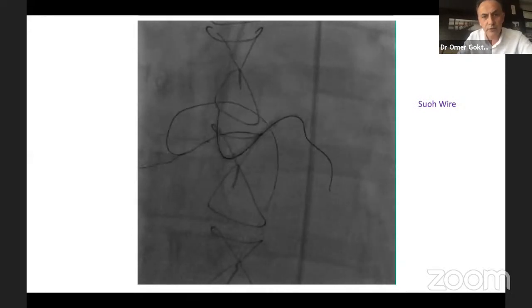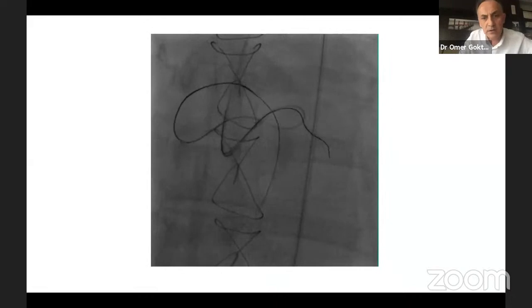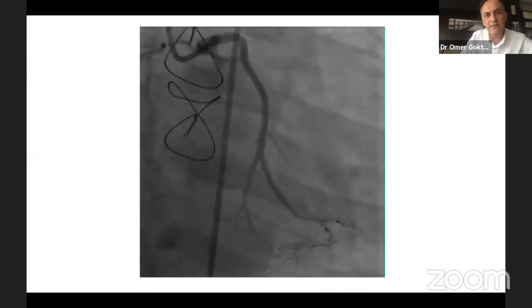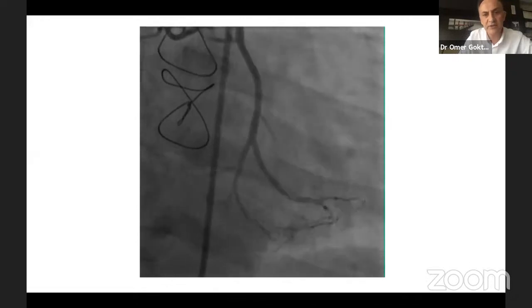Of course, another important thing here is to insert the microcatheter. After that, the situation is easy and more predictable. Now we are in the distal CIRC, and it's almost at the CTO. And easily we can do reverse CART here. After reverse CART, we have a nice CIRC artery. I think this is a post-CABG patient, and this patient needs this artery, even if it's not that big.